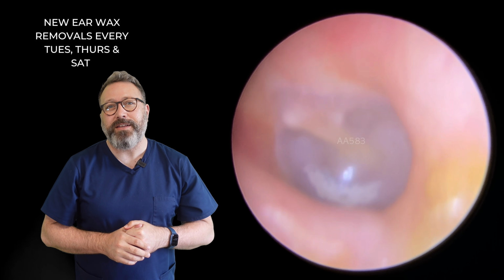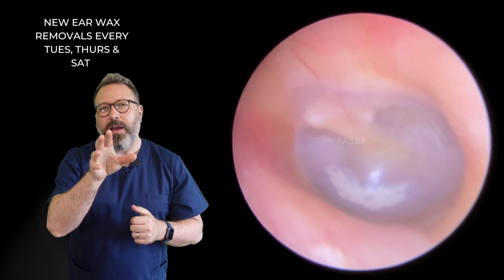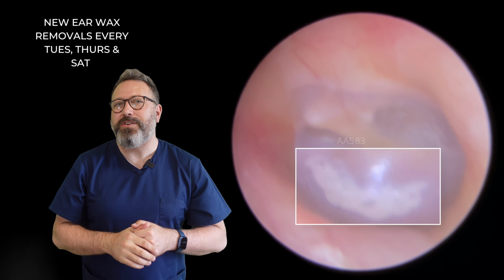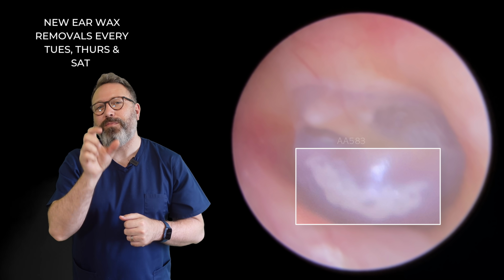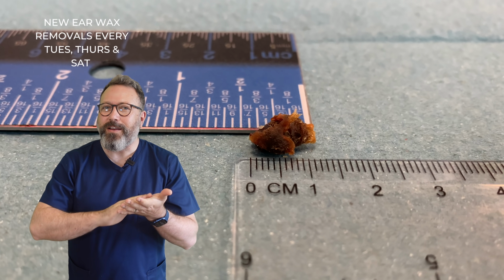If we take a look behind, there's the eardrum. Now there is a little bit of scar tissue, which I'll show you in a second. So this is what it looks like before and now after. That's a little bit of scar tissue. Now interestingly, this patient did have a history of perforation to the eardrum, and this is the scar tissue that's left behind. So you get these white cloudy patches.